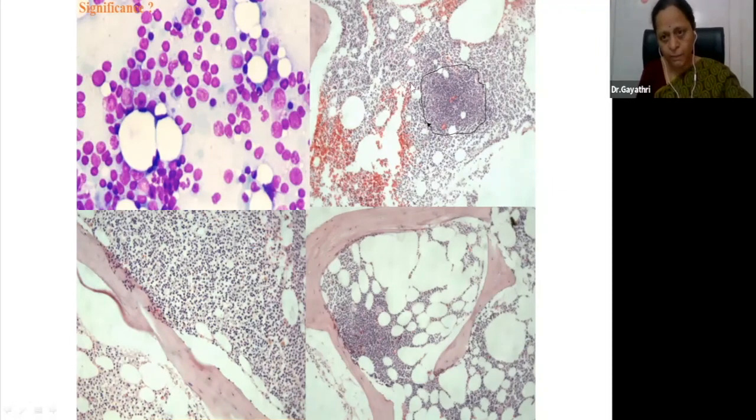If the lymphoid proliferation is like this, well-defined nodule right in the interstitium, you don't know whether these are neoplastic or reactive. So if you do not do immunohistochemistry to establish the nature of this lymphoid proliferation, you may not be able to tell whether this is a reactive, normal variation or a clone, a single clone of abnormal lymphoid cells.